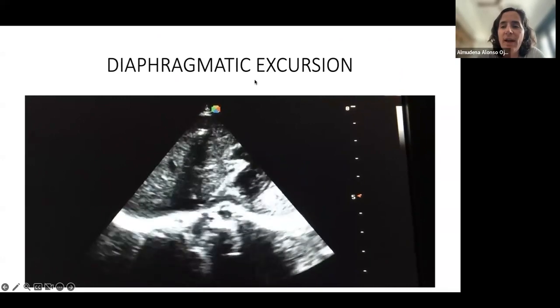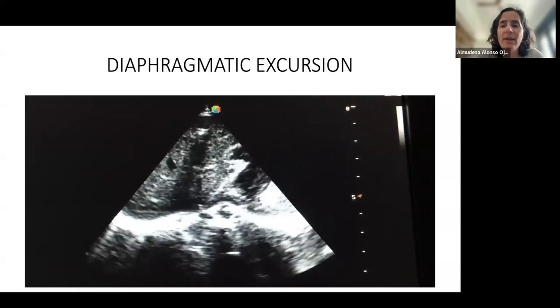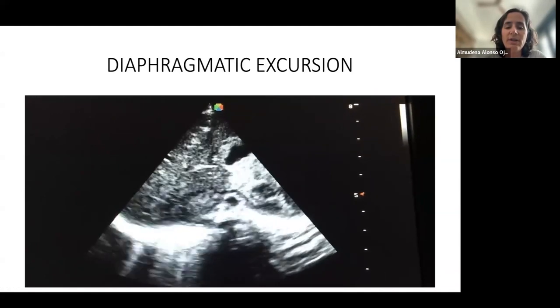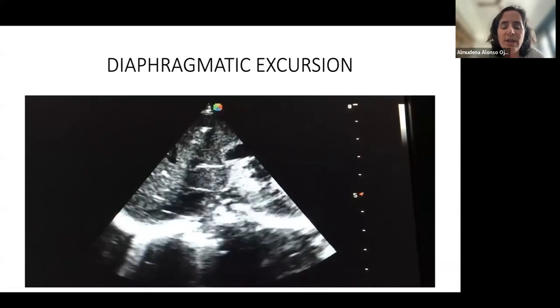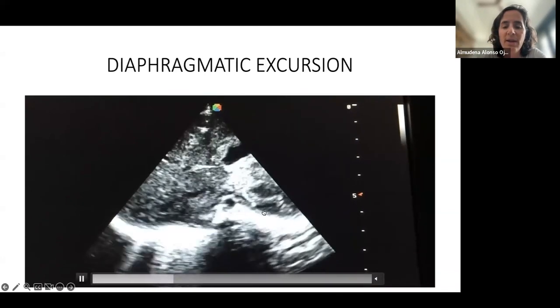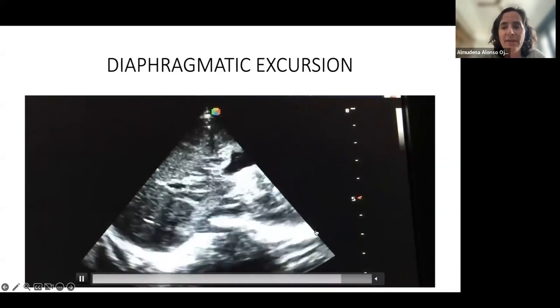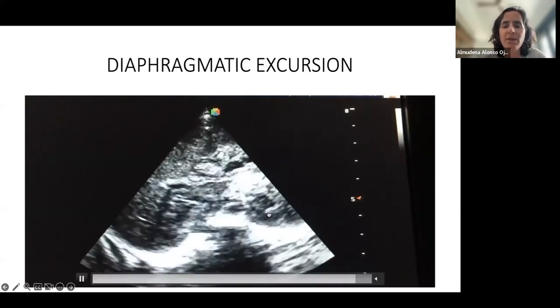We have the luck that neonatal patients are very small, so we can also measure diaphragmatic excursion from a subcostal approach, but in a transverse view that you will see in the next slide. In it you can see the liver, the stomach, the spleen, and this is the spine, and both posterior domes of the diaphragm are seen at the same time, so we can compare how both of them are moving in the same image.